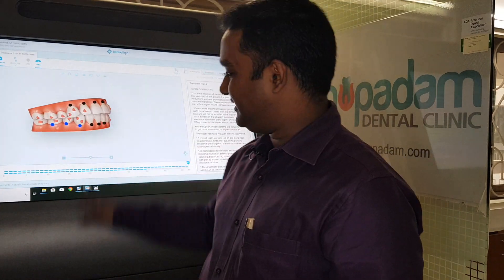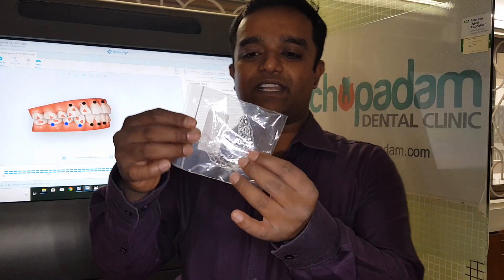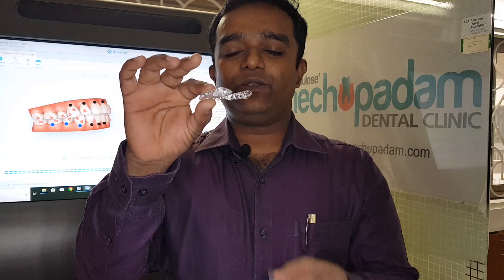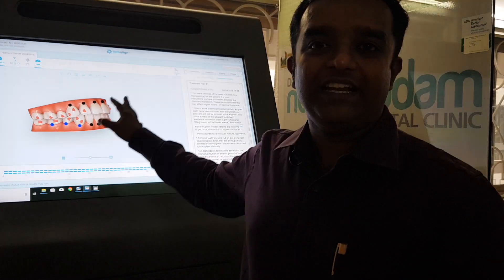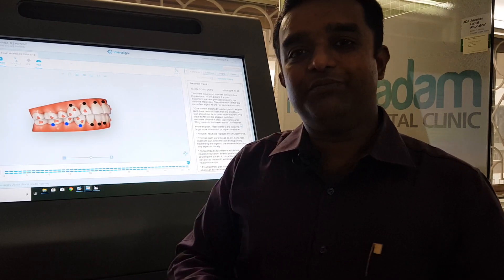Once this is done, you can see there are small lines representing each step — each step is 0.26 millimeters of difference between one aligner and the next. This is the aligner packet, a plastic tray that goes into the mouth. In Invisalign cases we use more aligners than a normal clear aligner company because they are changed every one week, allowing more precise movements.